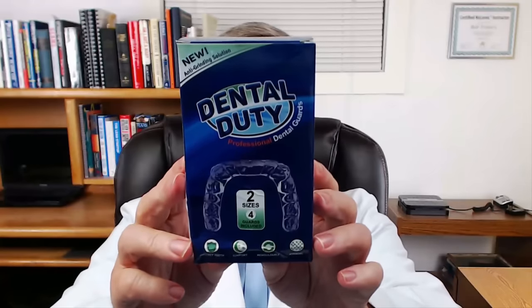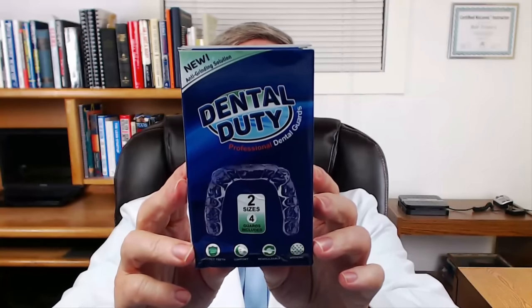So there you have it. You've seen how easy it is to use the Dental Duty dental guards to mold a good, tight fit, comfortable, and protect your teeth at night. These are made by Dental Duty — they're professional dental guards. Why Dental Duty? First of all, they come in two different sizes. They use dental-grade material. It's easy to do the mold. And they guarantee their product. Dental Duty professional-grade dental guards.